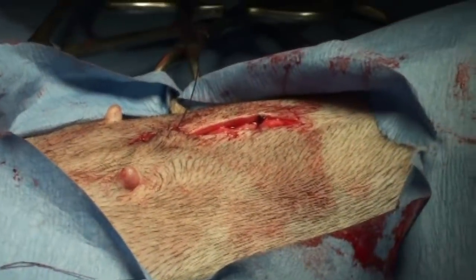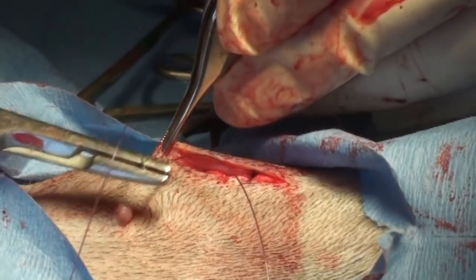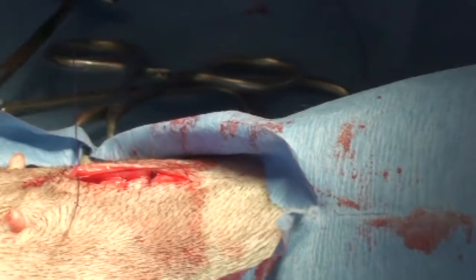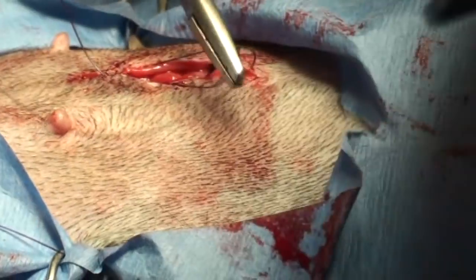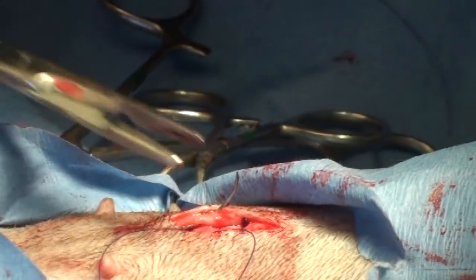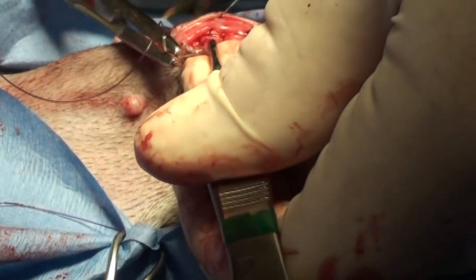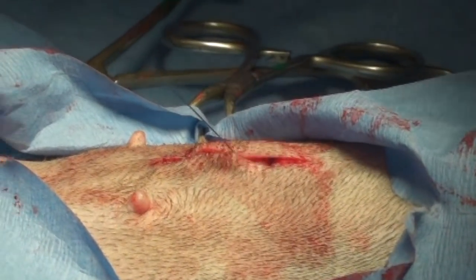Now I'm going to make it a continuous suture again, so I'm only going to cut one side and we're going to keep going, just sewing the skin all together like that. The needle's pointed up and instead of going through the skin, I go inside and then down on the other side. See how it all goes together? Now this stitch will dissolve in a few weeks. If the sub-Q sutures look good, then the incision — I might not even put any skin sutures in.